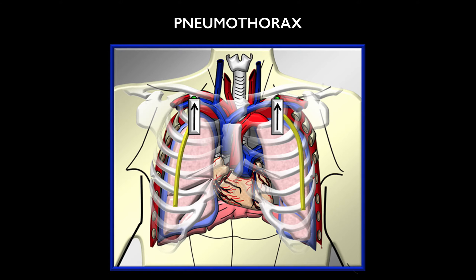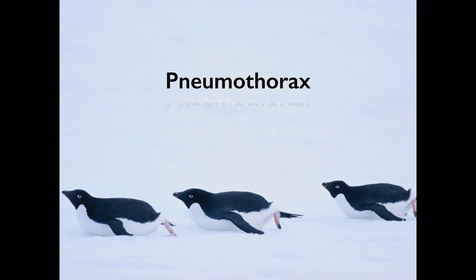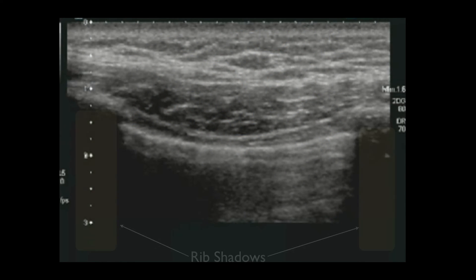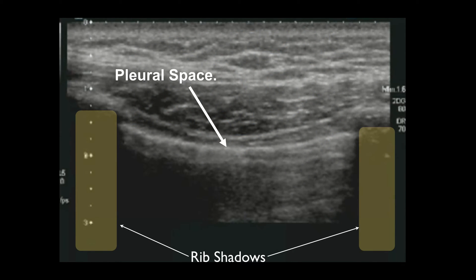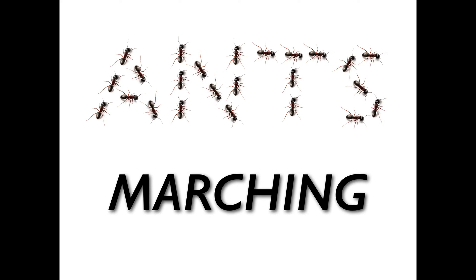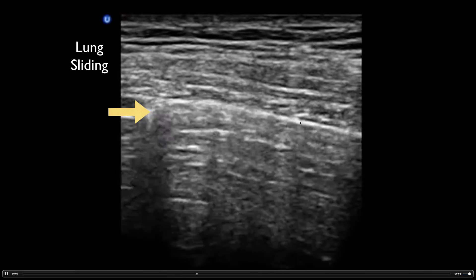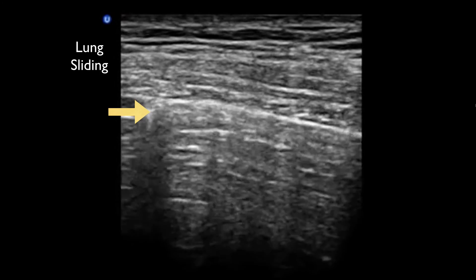Finally, you'll rule out pneumothorax by looking for lung sliding. You can use a phased array or linear probe. Place the probe at the second intercostal space with the indicator towards the patient's head, and look for rib shadows and the hyperechoic pleural line. What you're looking for is what looks like ants marching in a line — the visceral and parietal pleura sliding against each other as the patient breathes.